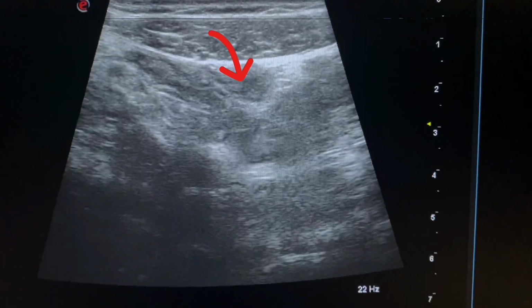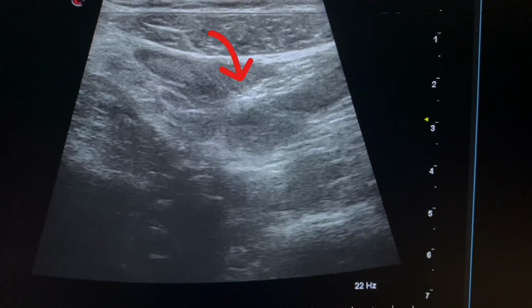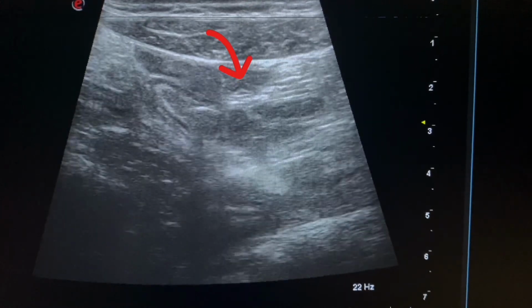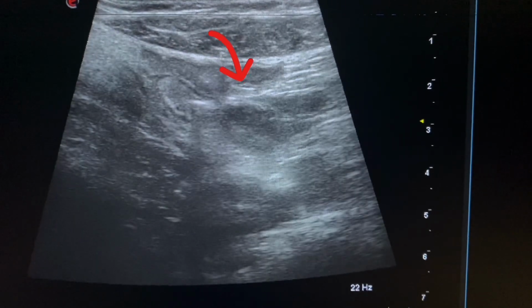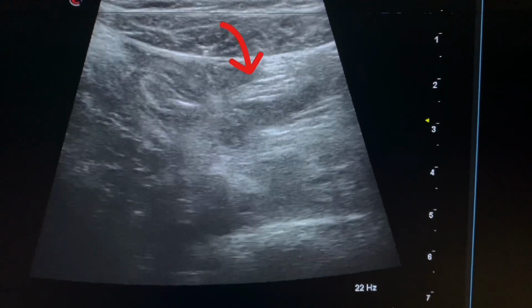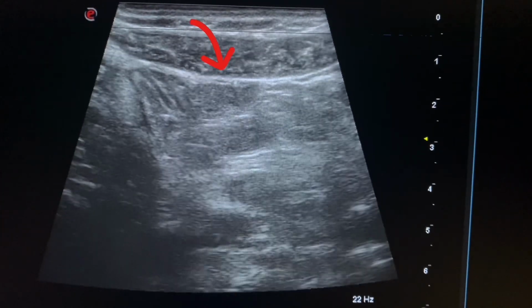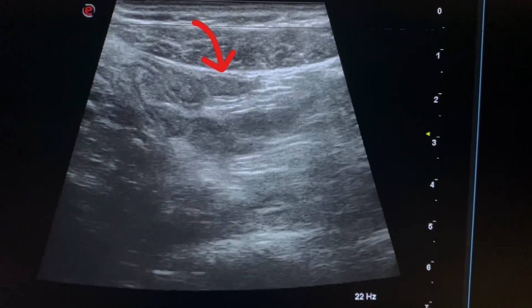These are multiple worms, or ascaris, which are present in the distal ileum. Remember that worms can also cause lower abdominal pain or bilateral abdominal pain. Mostly this pain starts at evening time. The wall of the distal ileum is normal.